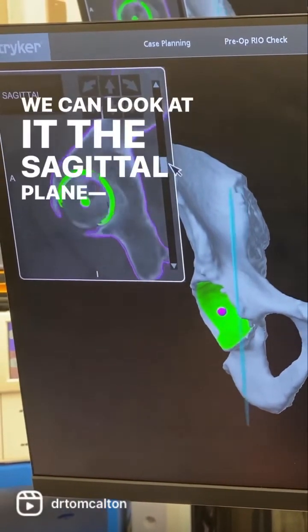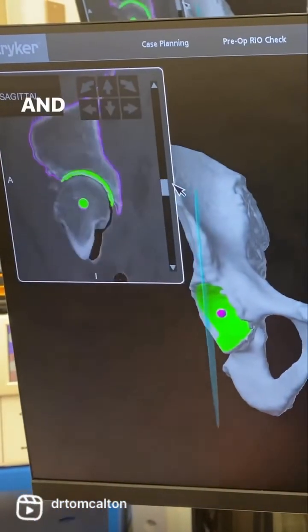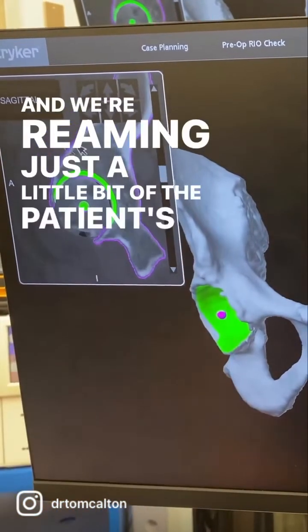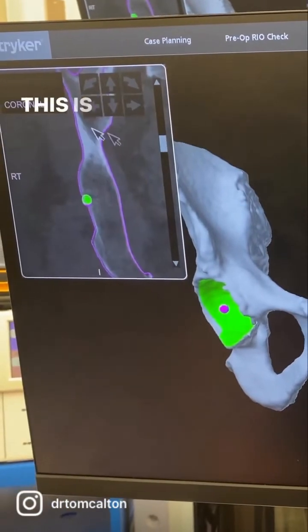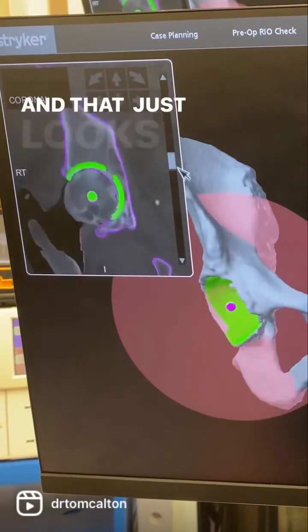We can look at it on the sagittal plane, and that's cutting the patient right down the middle and going up and down, and we're reaming just a little bit of the patient's body to make room for the cut. This is a coronal plane, and we're going from front to back. I think this looks spot on.